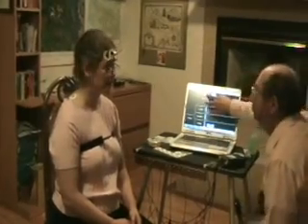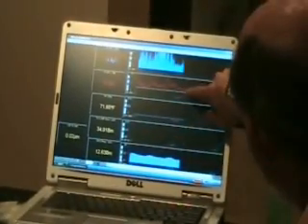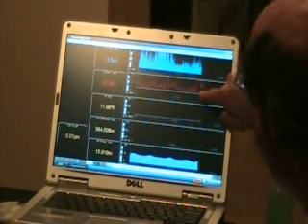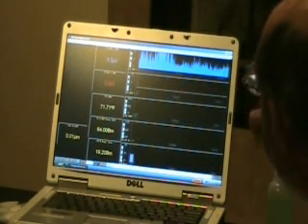So, Barb, you can look at this if you want. Here are the two channels of muscle tension. And I have these two graphs just set up. So this is filled in, this is not filled in, but it's just showing the higher on the graph, the more tension.